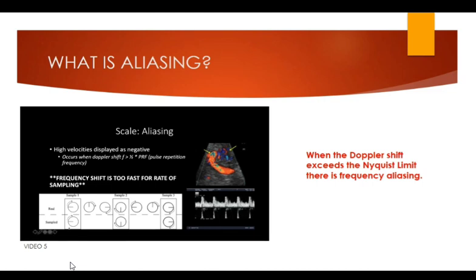But when we sample it with a video camera, which is essentially sampling intermittently, if we just look at what we're sampling, so we sample here, then here, then here, if we didn't know what was really happening and we just saw the sampled areas, if we look at the markers, we see that it's pointing left, then down, then right, and despite the fact that we know the wheel is rotating clockwise, it looks like it's rotating counterclockwise. So it's all just about sampling frequency, and that's what this example illustrates.